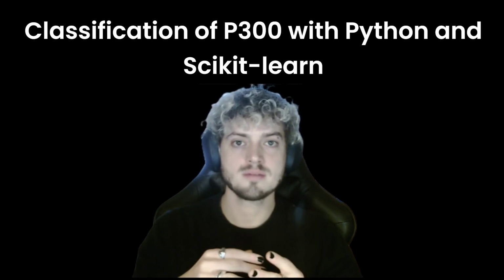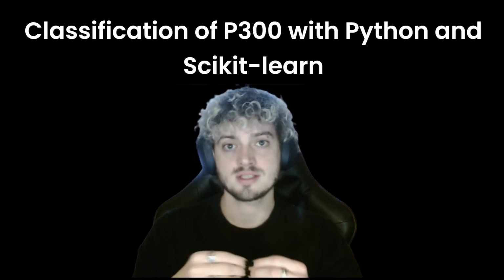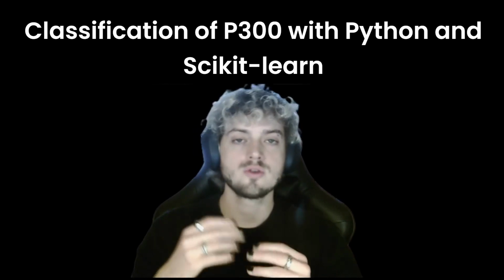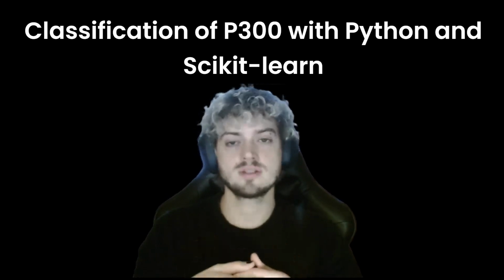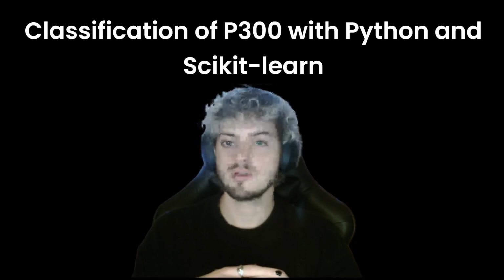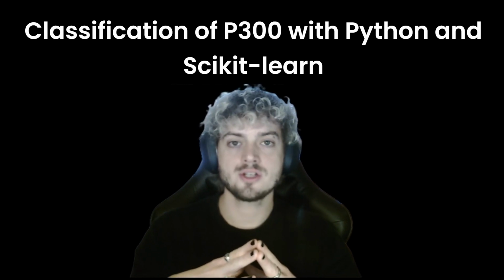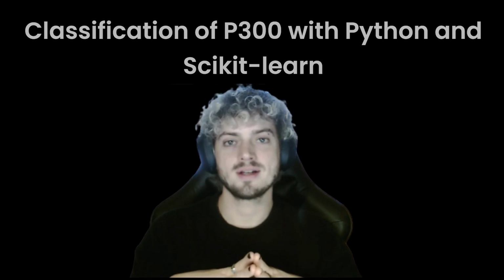I will show a simple method to get you started, and then some pre-processing steps that you can take to improve the classifier. We use the same dataset as in the previous video, the auditory P300 task. You can repeat it on your own, in Colab or in your local Jupyter installation. And when you're feeling confident, I invite you to use your own data and try to achieve the same or similar results. So let's get started.